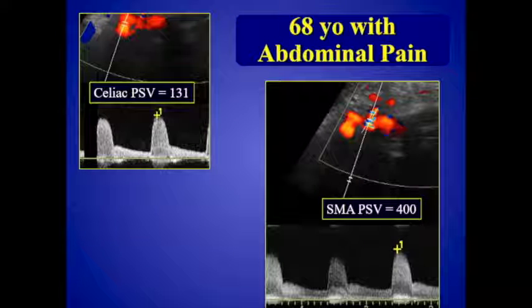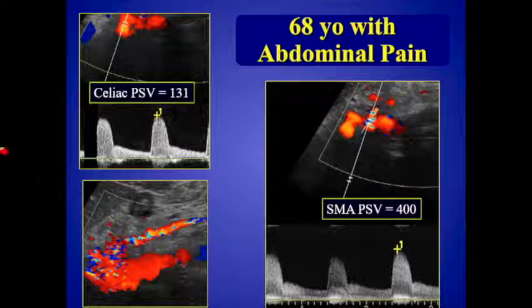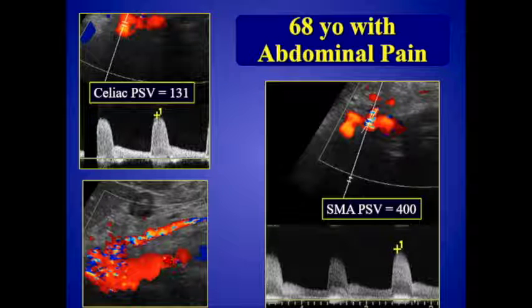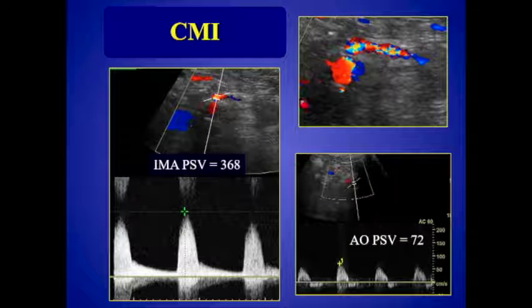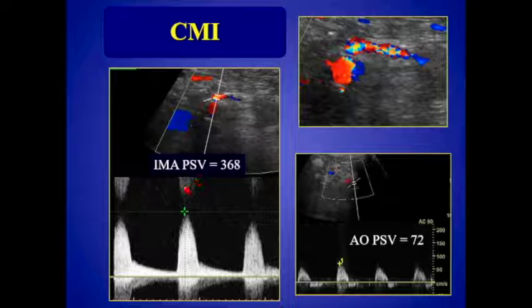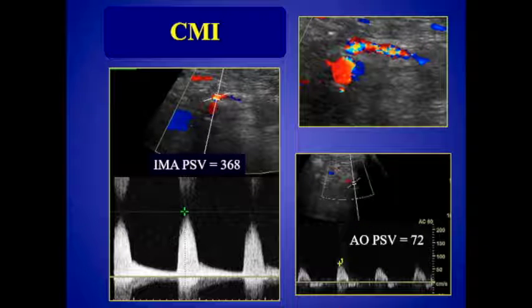Here's an example: a 68-year-old with abdominal pain. The celiac peak systolic velocity is 131 cm/s — within the normal range, under 200. But looking at the superior mesenteric artery, there's aliasing and a color bruit artifact at the origin. When we place the sample volume angle-corrected to the direction of flow, the velocity is 400 cm/s — clearly a high-grade stenosis. Checking the inferior mesenteric artery, it also shows aliasing with a peak systolic velocity of 368 cm/s, compared to an aortic velocity of 72 cm/s. So we have two-vessel disease consistent with chronic mesenteric ischemia.